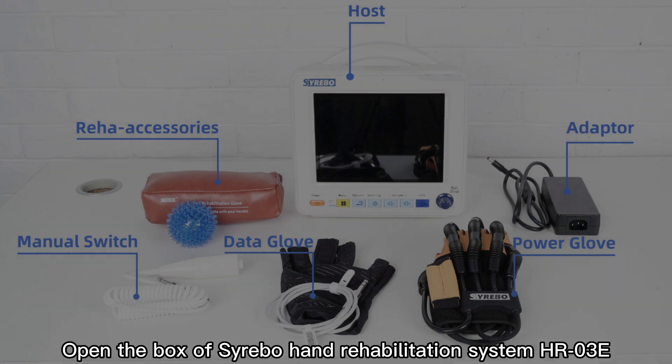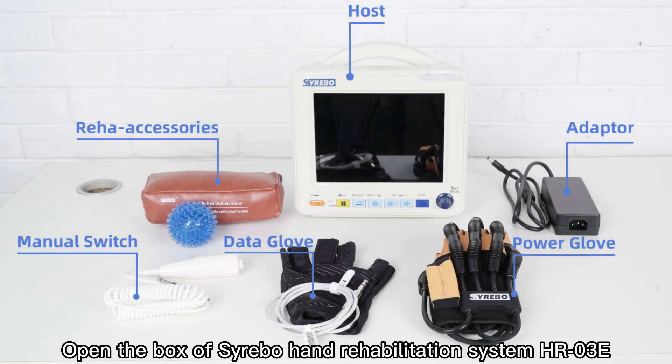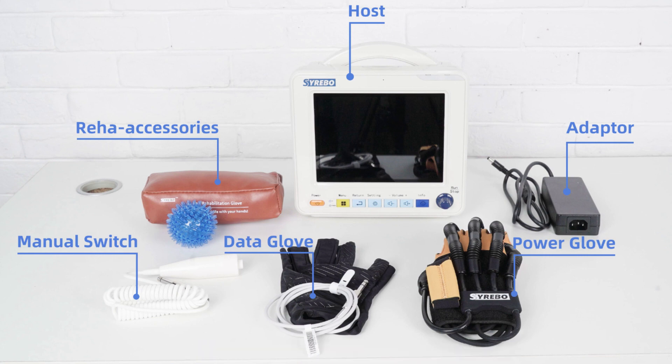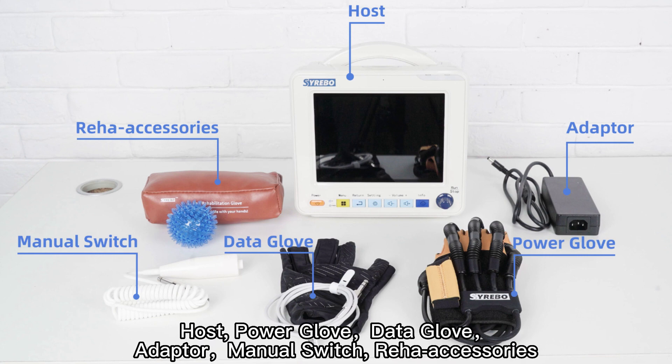Open the box of Syrebo Hand Rehabilitation System HR-03E. You will have the following components: Host, Power Glove, Data Glove, Adapter, Manual Switch, and Reha Accessories.